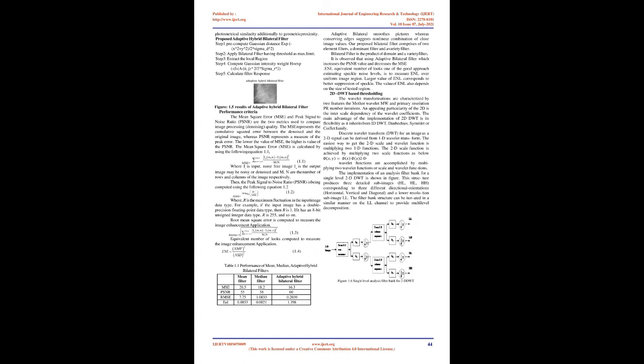The goal of denoising the image is to use appropriate techniques of refining the images so that the resultant image would have a better visual quality free from aberrations and noises. Noise modeling in images is affected by capturing devices, data transmission media, image quantization, and discrete source of radiation. The characteristics of noise depend on its source.